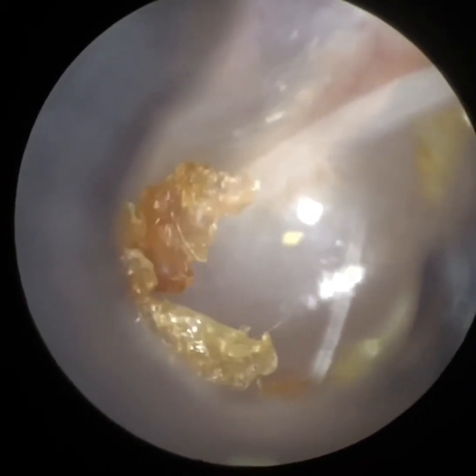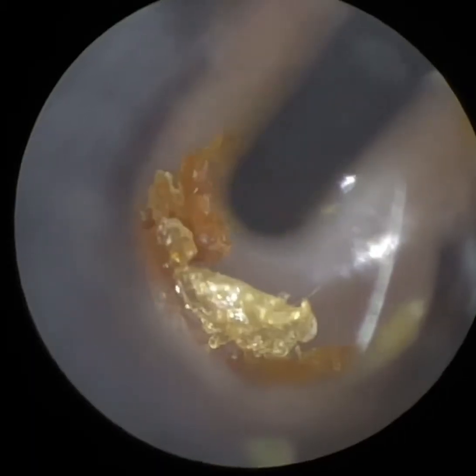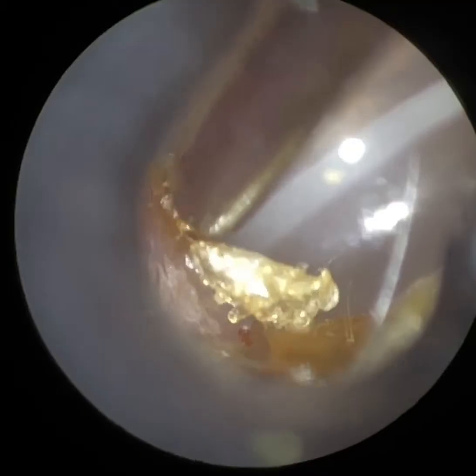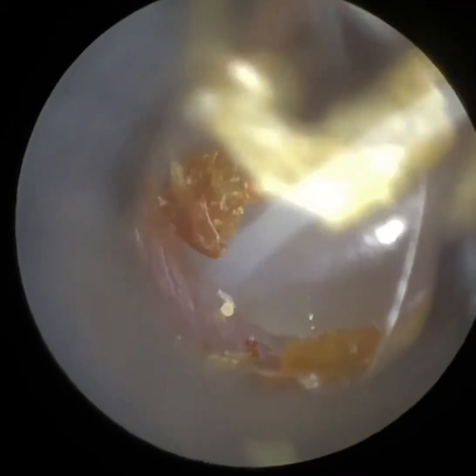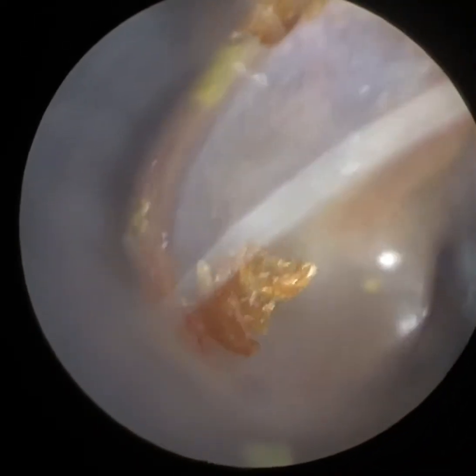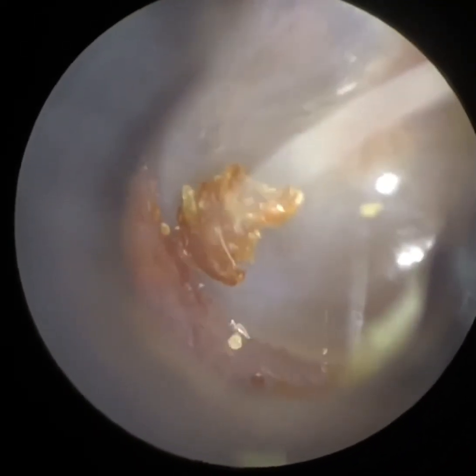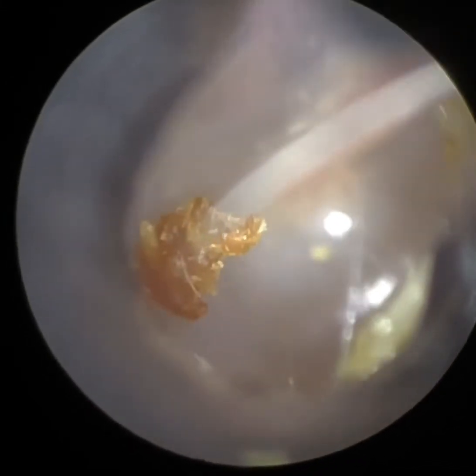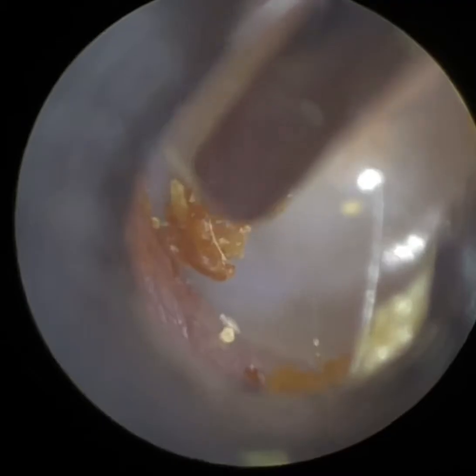Again, this is all dead skin. In this particular patient the skin, as it dies, it's not really shedding — it's crystallizing within the ear. And that piece there is a good example: it's like a shard of glass. So every time the patient's moving the jaw, it's a bit uncomfortable. This was a bit of a tricky bit to remove — it was still attached to the canal wall, it wasn't loose, and I had to really peel it. It took me a couple of attempts.